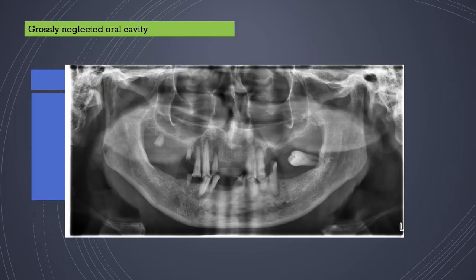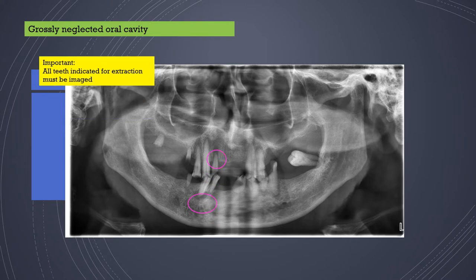Let us look at some images to understand where and how panoramic imaging can be useful in diagnosis. Most images are from our own archive for educational purposes. This is an example of a grossly neglected cavity showing multiple decayed teeth with multiple periapical pathologies.